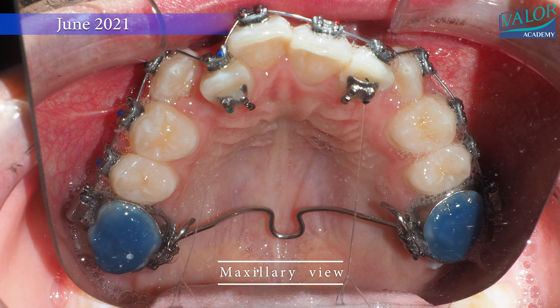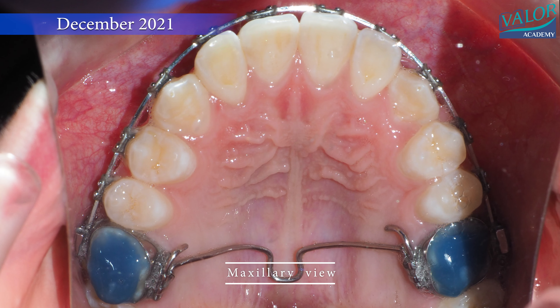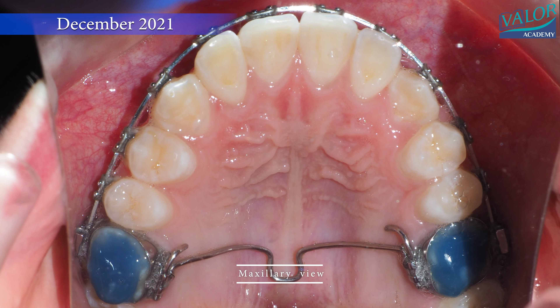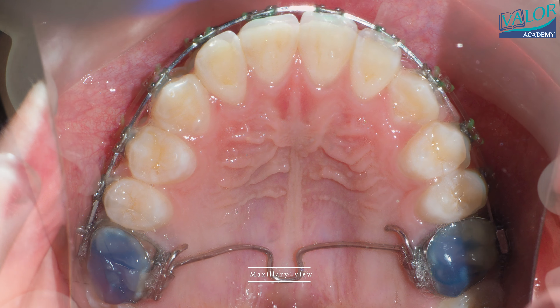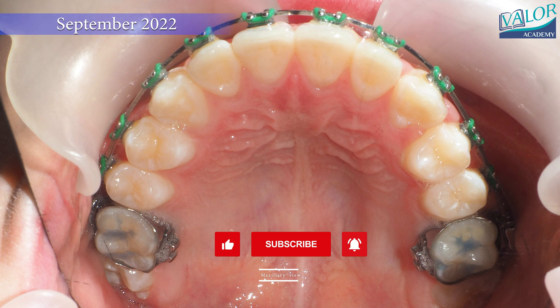After the braces are removed, we wait for growth to stop to conduct a final orthodontic analysis and determine the best way to finalize the case, which may involve extractions or orthognathic surgery.